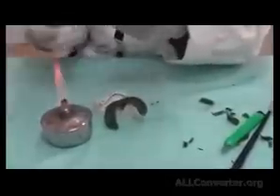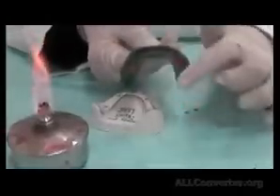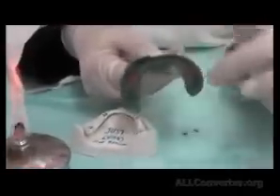So you can notice now that the material is following the depth and width of the sulcus all around without an excess material. The continuous roll is all present all around. I could do a final border molding, just heating everything up on all the borders, just a quick one. Go into warm water and do my final squeeze all over the tissue.